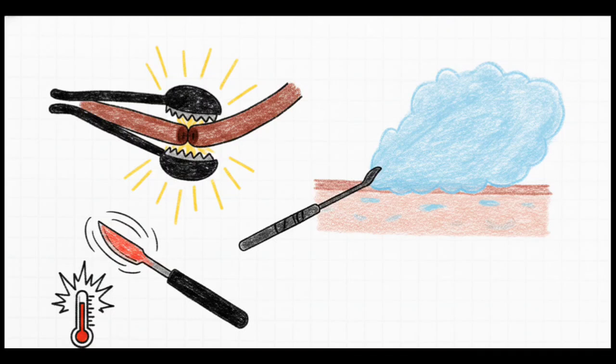Bipolar devices, for instance, contain the target tissue directly between two electrodes. This allows you to safely fuse and seal vessels up to 7 millimeters in diameter, and it does so with very minimal thermal spread. Then we have argon beam coagulators. These use ionized gas, which is just incredible for achieving hemostasis over large, raw, bleeding surfaces.